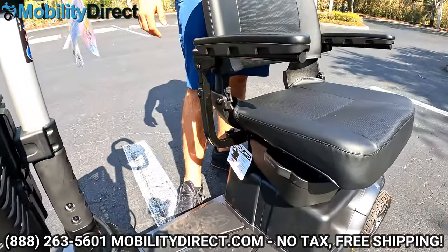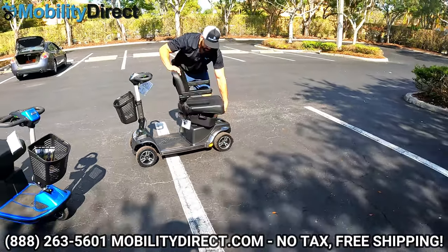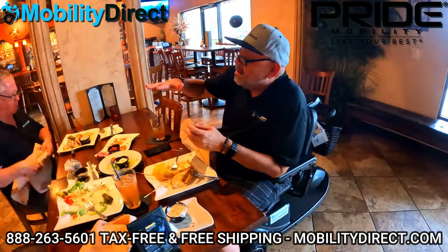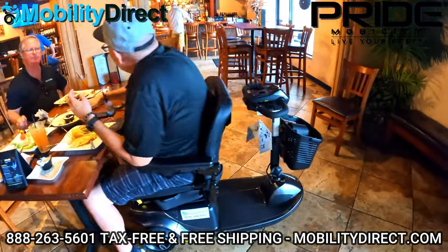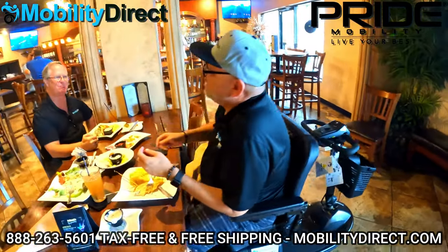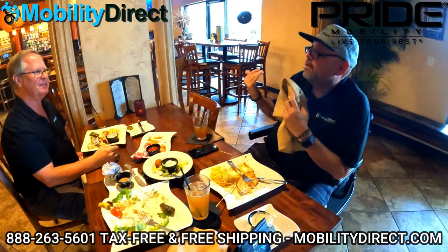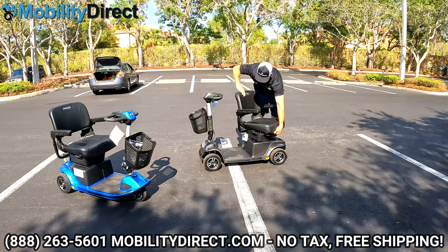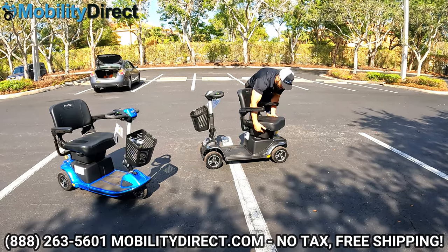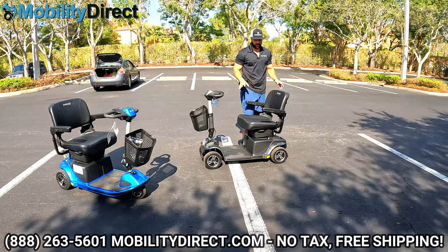The seat rotates 360 degrees, so if you want to pull up to a table to enjoy a meal, you can rotate the seat backwards and you don't have the handlebar assembly in the way. We actually have a video showing what it's like to go on a dining experience at a restaurant with this model — check it out on our YouTube channel. Aside from rotating 360 degrees, it also has the ability to adjust the seat height.